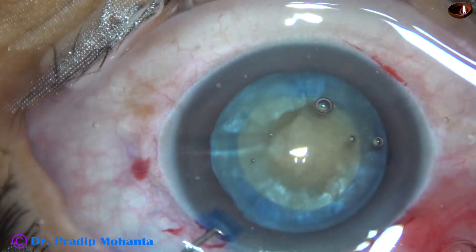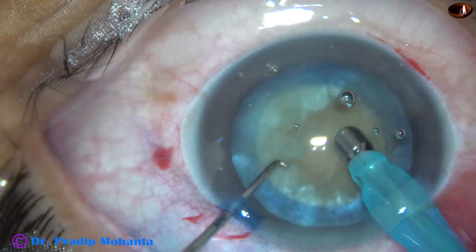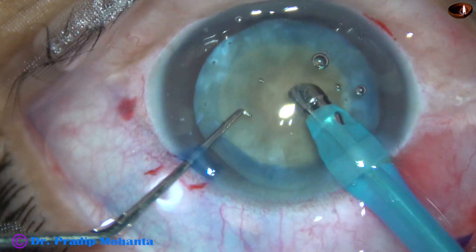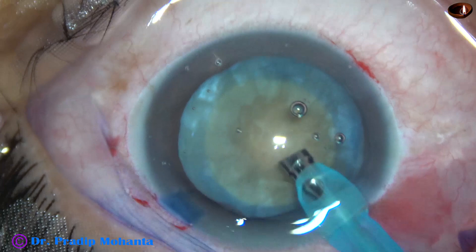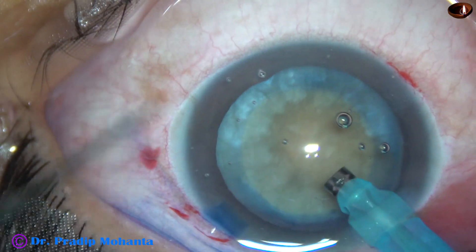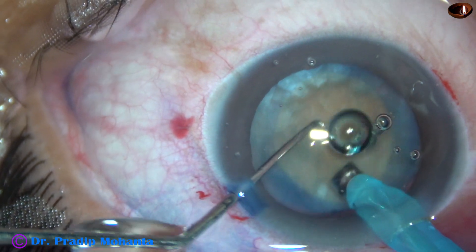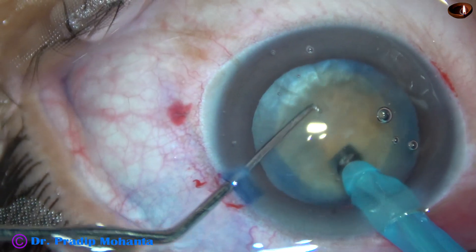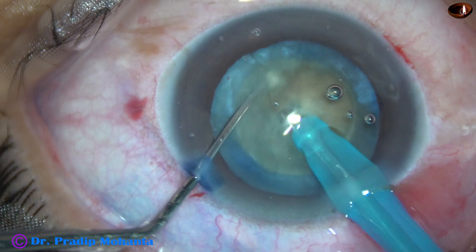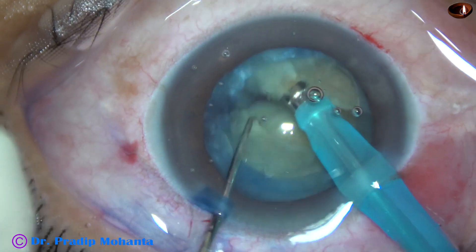This is a rhexis of about 5 mm, and this is a moderately hard nucleus. I am going to divide this nucleus with my technique — I call this the submarine chop. The tip goes through the substance of the nucleus towards the opposite equator and it is chopped.